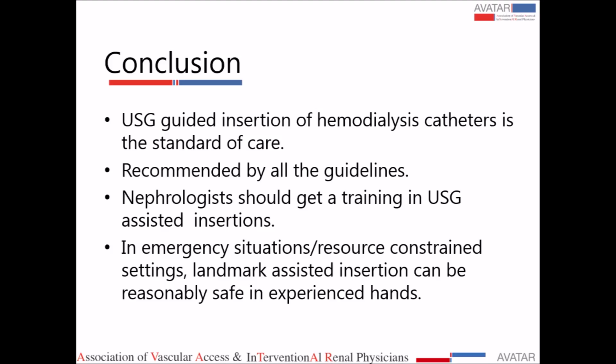Nephrologists should get training in ultrasound assisted insertion. However, in an emergency situation or resource constraint setting, landmark assisted insertion can be reasonably safe in experienced hands, but it always comes with a learning curve.